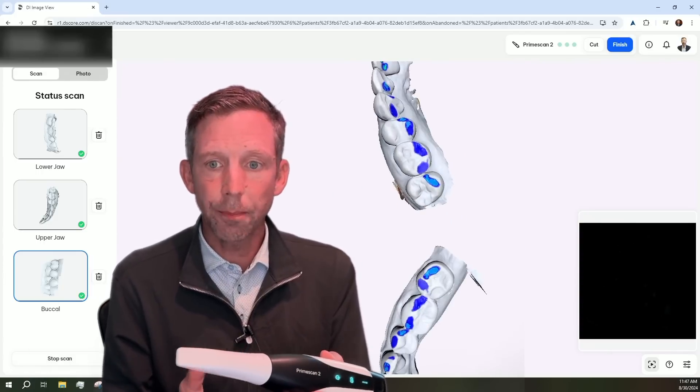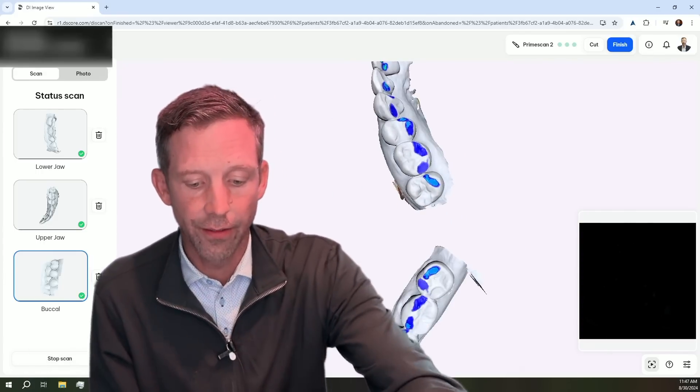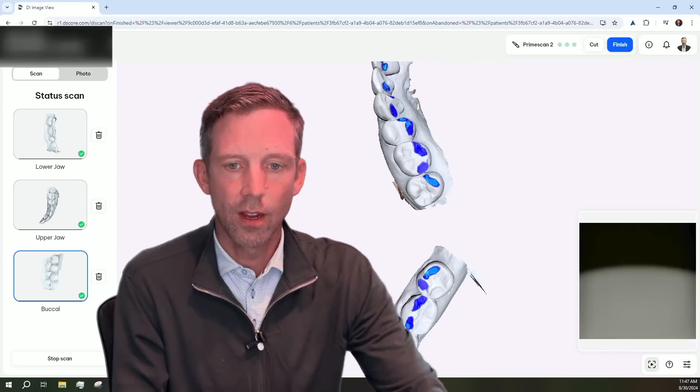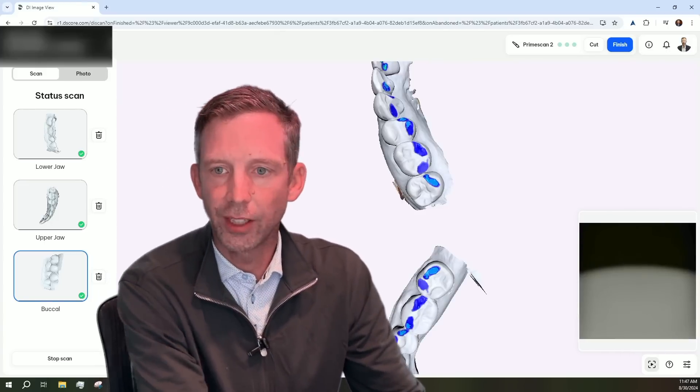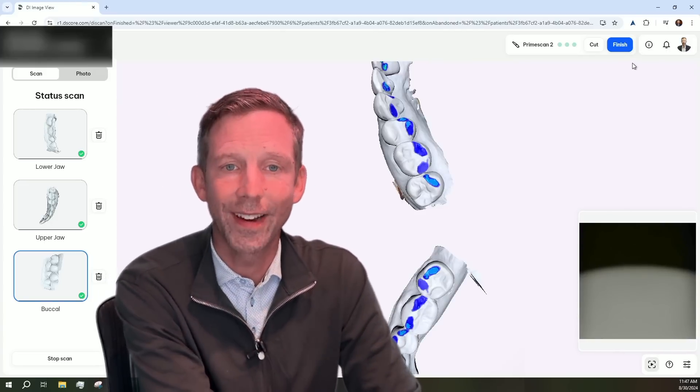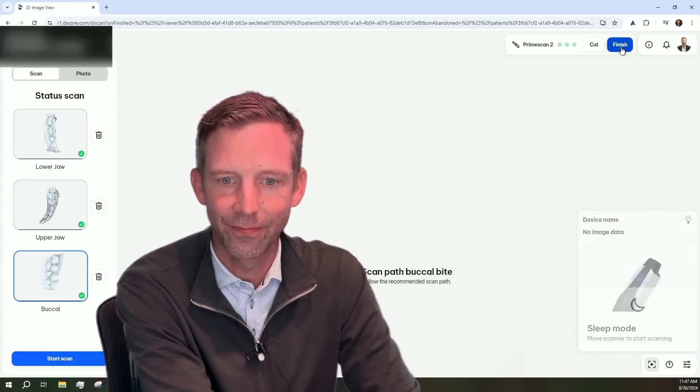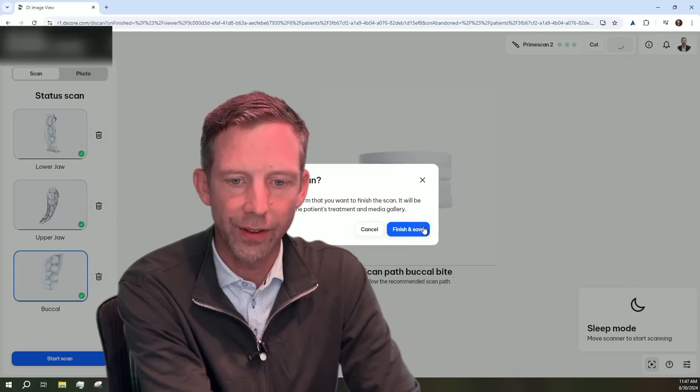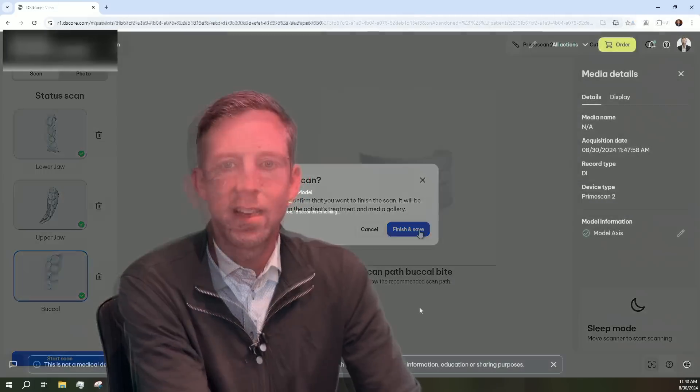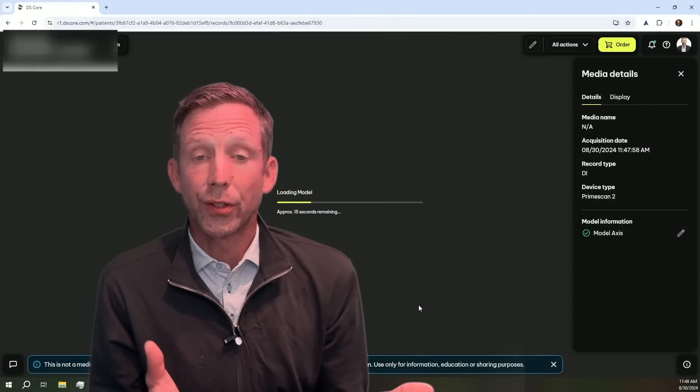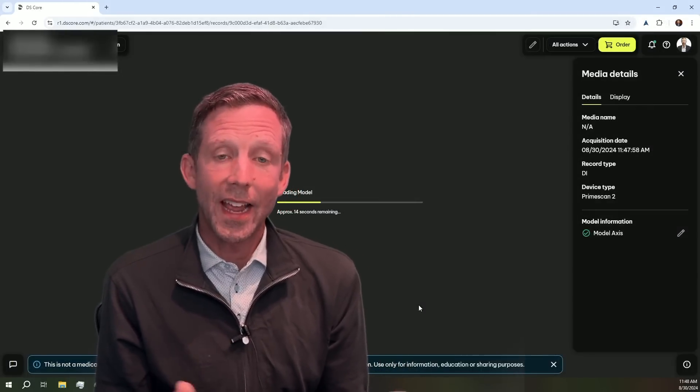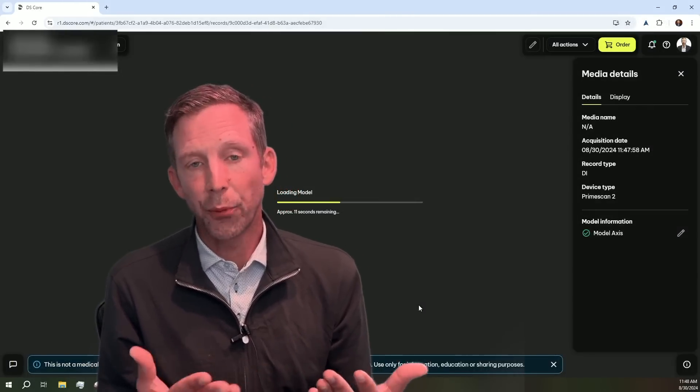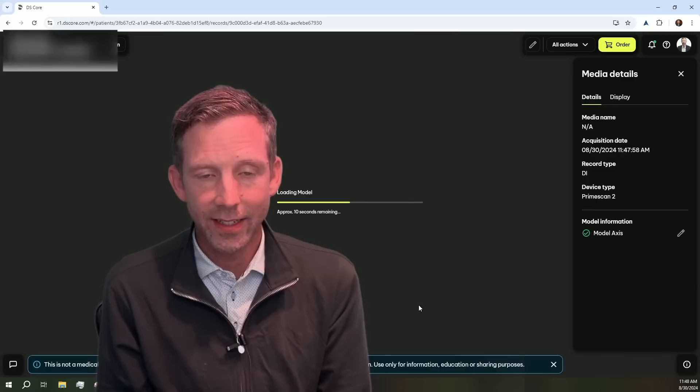Now, once you're complete, we'll go ahead and click Finish. So you see the Finish button there on the upper right-hand side. We'll go ahead and click the Finish button. Do you want to Finish and Save? Yes, we do. Now, as soon as you hit Save, you'll notice now the model is being processed and uploaded directly into DS Core.